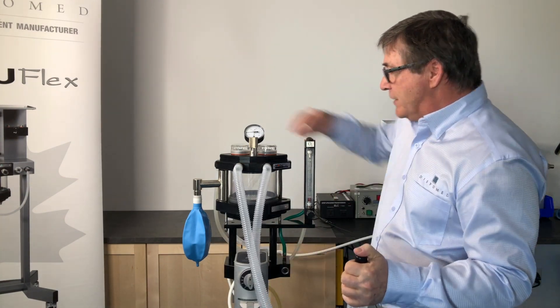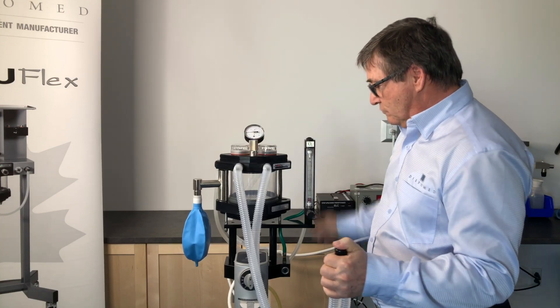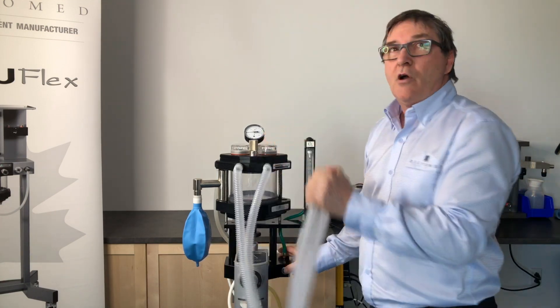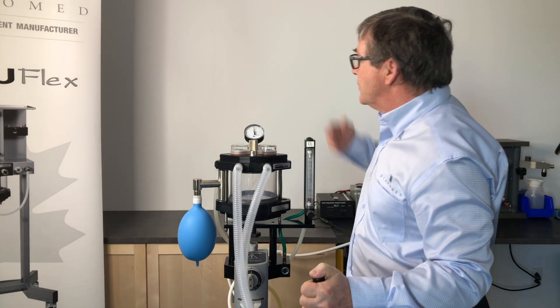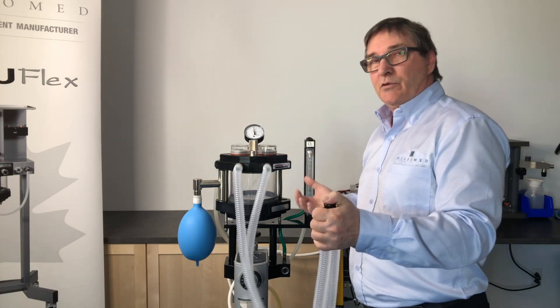We close the pop-off valve, press on the flush valve, and increase the pressure until we reach approximately 30 centimeters on our patient circuit gauge. We observe the gauge. If the gauge does not fall, we have no leak.